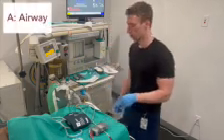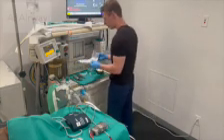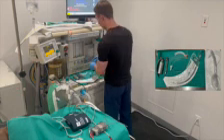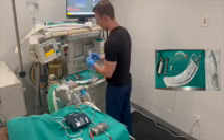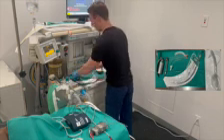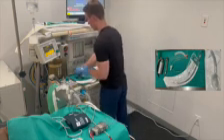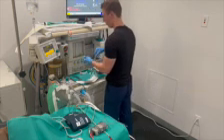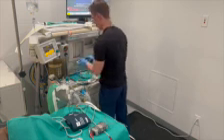The next letter is A and involves every device for the airway. We want to have a mask available. It's helpful to have 2 strips of tape on the mask for when we tape the eyes closed. An appropriately sized OPA should also be within easy reach in order to ventilate a patient more easily. A laryngoscope and blade will be necessary for direct laryngoscopy. Make sure that you have a MAC blade size 3 or 4, depending on the patient's size, and Miller blade size 2 or 3. Having multiple blade options allows for a quick change in airway manipulation strategy.